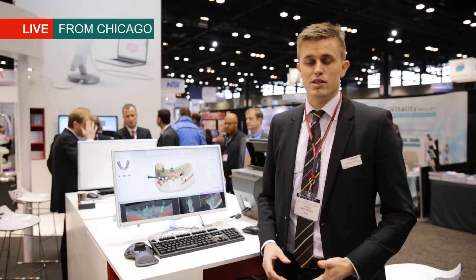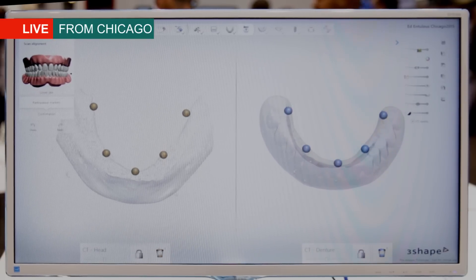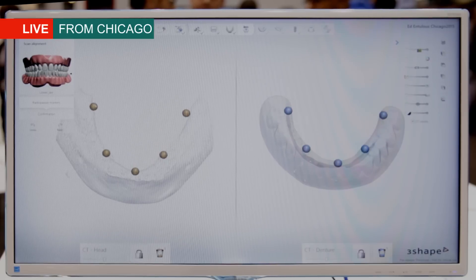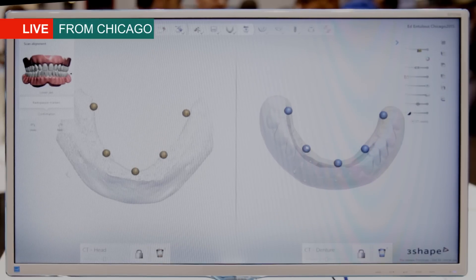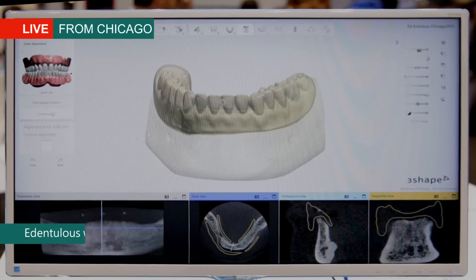What we have here is basically the input data to our edentulous workflow. On the left we have the patient CT scan, and we can see that the software has automatically detected the radiopaque markers. On the right hand side we have the CT scan of the denture, and again the software has automatically detected the five radiopaque markers.